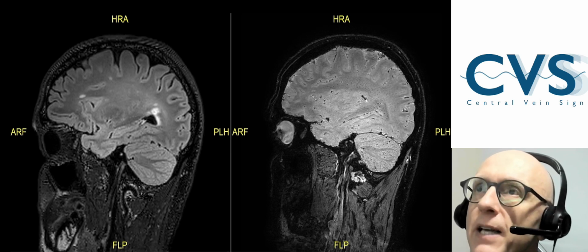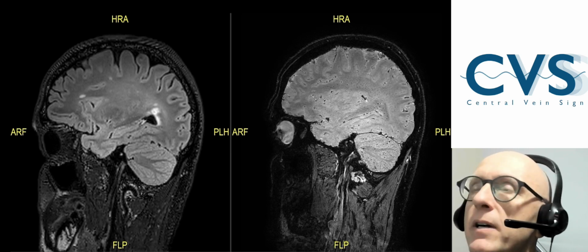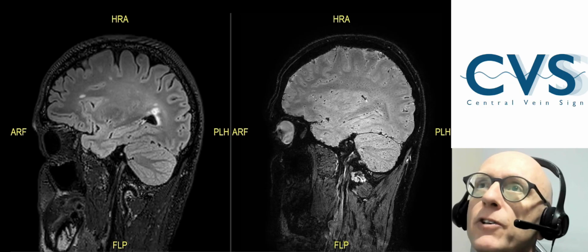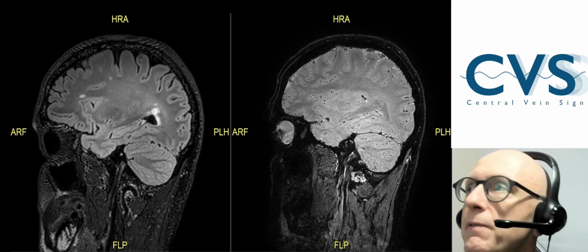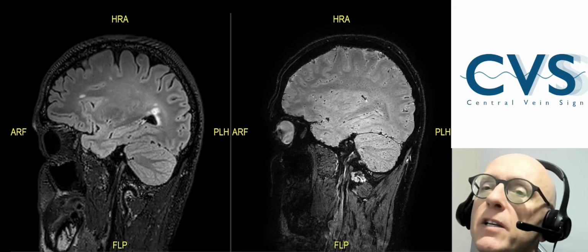We've been doing this type of scan here in Nottingham for a few years now and have been using it in our new MS diagnosis cases and using it particularly as a problem-solving tool. So I think we've got a reasonable amount of experience of using the central vein sign in practice.